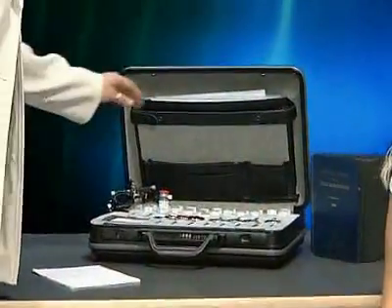I'm now going to show you how to assess a patient with academic skills disorder or dyslexia. This is done in very much the same way as for a colour deficient patient, only the tests used are slightly different. The system includes several different tests for reading, writing, and spelling. Patients who suffer with academic skills disorder tend to have individual requirements, so the tests reflect this — covering reading difficulties, spelling, and the crowding phenomenon, where patients have difficulty with words that aren't correctly spaced. For this demonstration we're going to assume that Zara has a reading disorder.